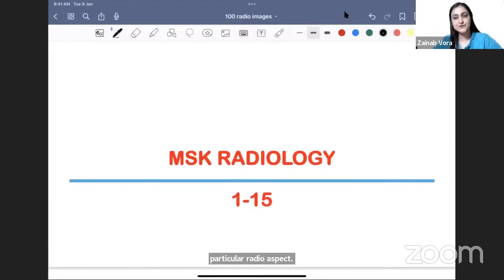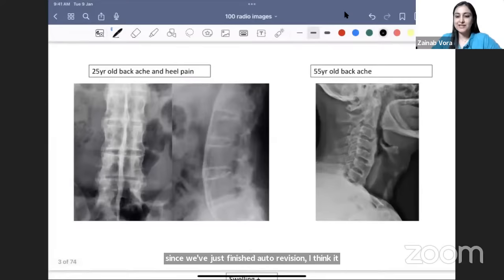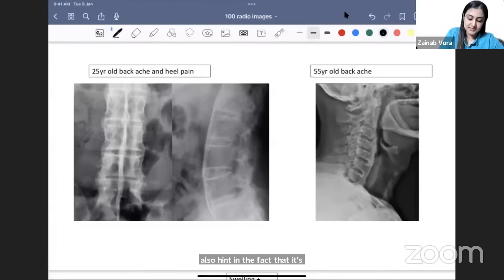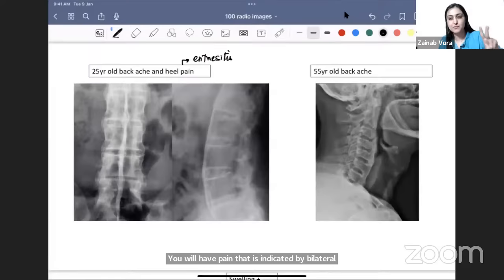Since we've just finished ortho revision, MSK should be very easy. The first case: two very similar spine cases that come as options in the same question. A young male with backache and bilateral heel pain — the bilateral heel pain points towards enthesitis. Anywhere there is ligament and tendon insertion and you have inflammation, that is known as enthesitis. Achilles tendon insertion at the calcaneum causes pain, indicated by bilateral heel pain.